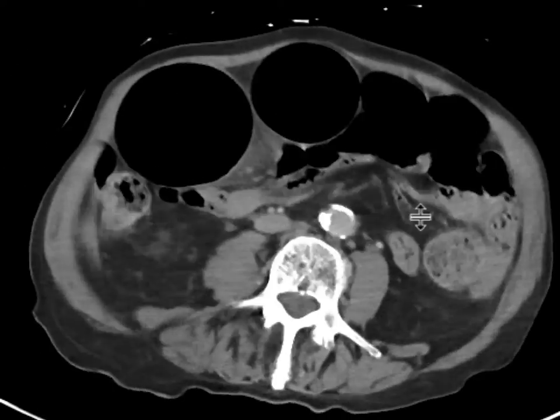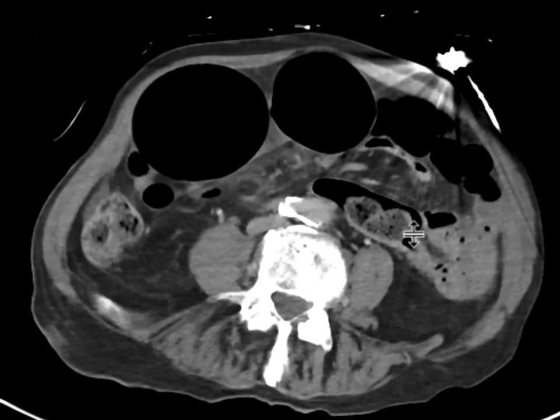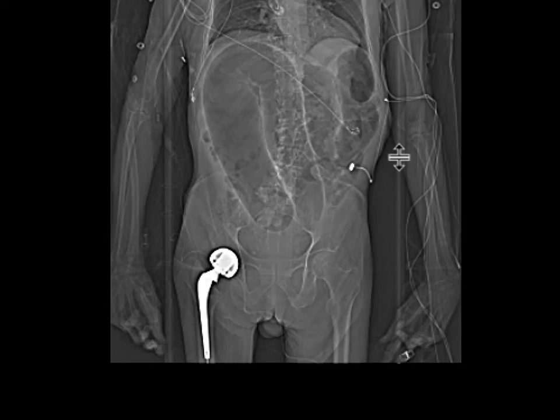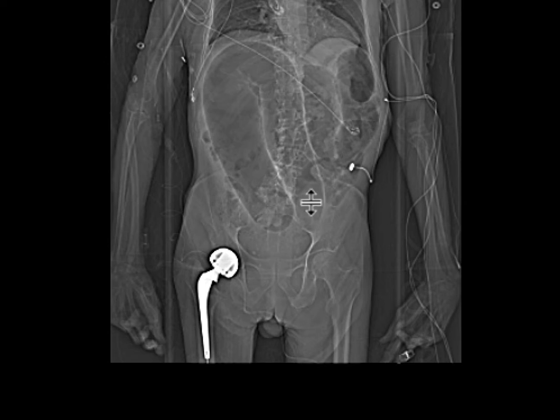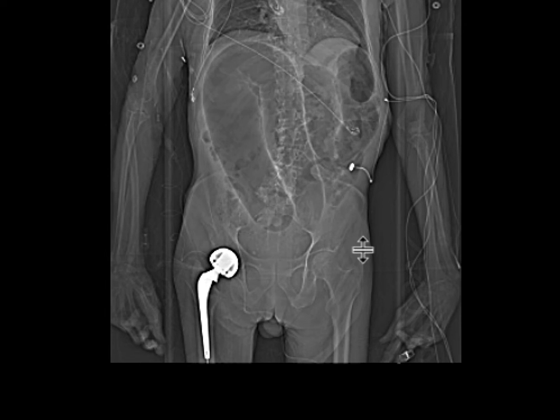This is indeed a very good look for sigmoid volvulus in this patient. Examining the scout radiograph associated with this, you can see that U-shaped loop of bowel going to the right upper quadrant, quite distended. The loops upstream are also distended — a very classical appearance for sigmoid volvulus.